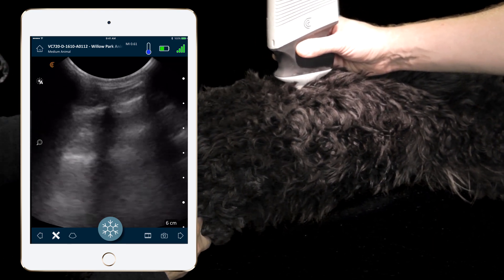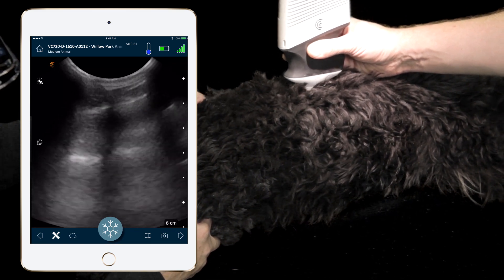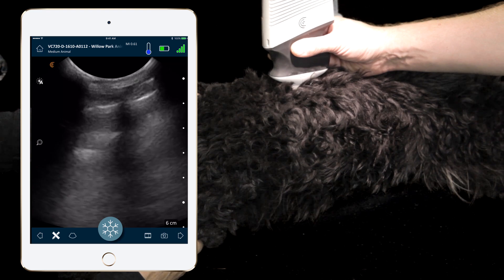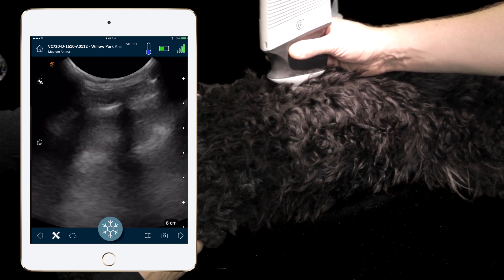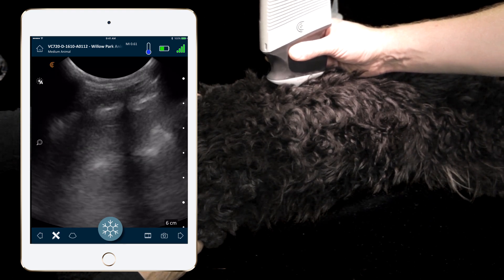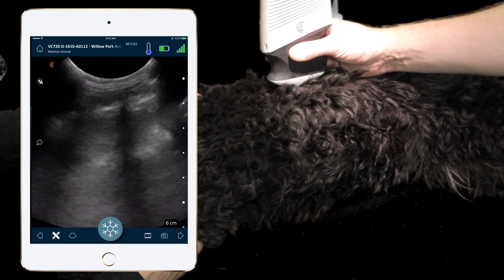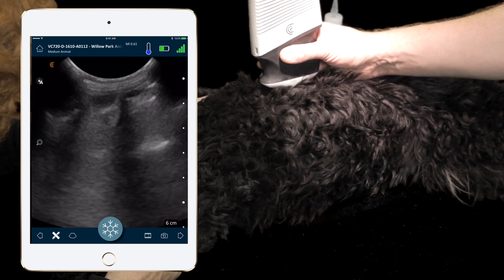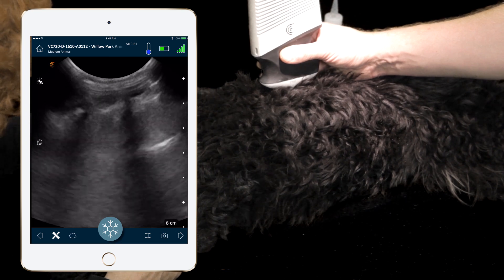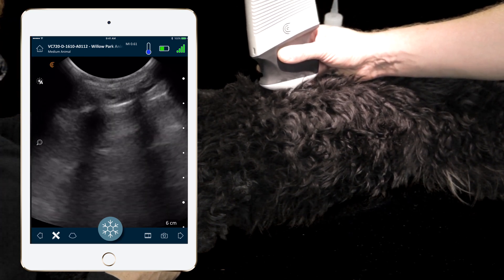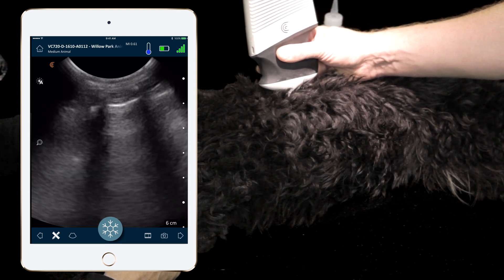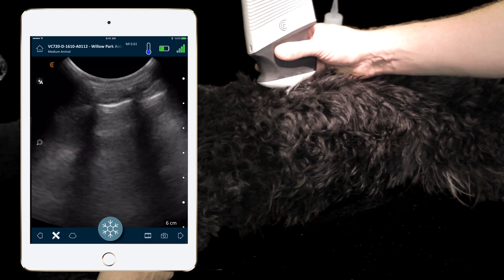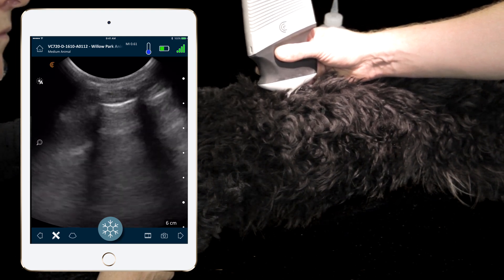We place the ultrasound probe at this location and you'll see a classic orientation with some rib shadowing. We then look for the first white line after the rib shadow — that's our parietal pleural interface. Holding the probe still, we look for a shimmer or glitter of motion along that interface. We can see speckling along the line between the ribs; if the probe is too perpendicular it appears quite white, but by adjusting the probe angle we reveal motion at the cranial part of the image.